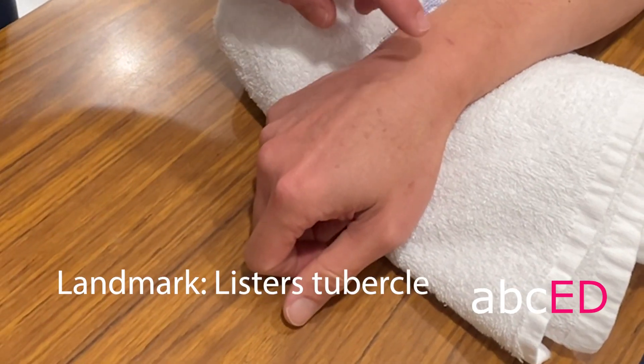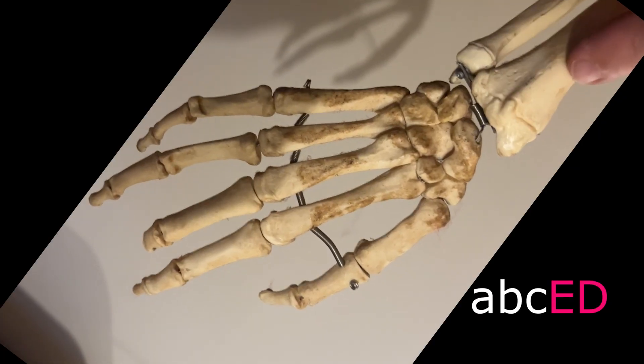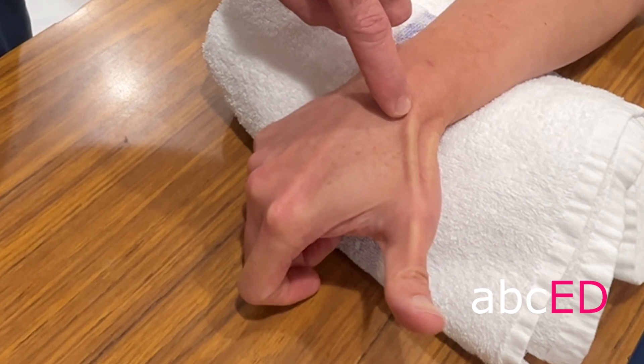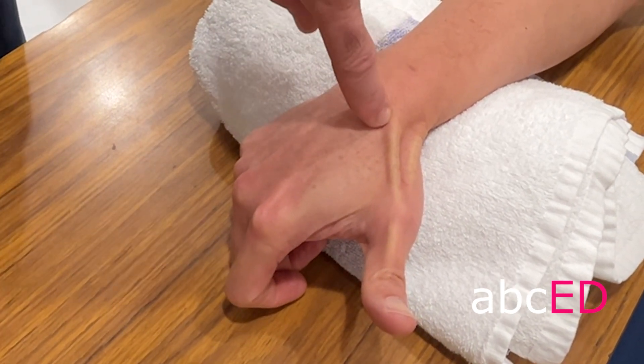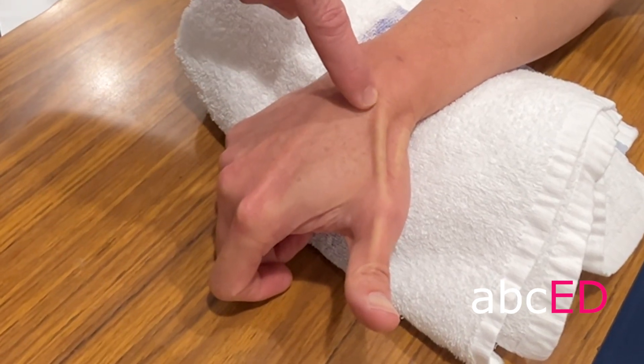The landmark is Lister's tubercle, which is the distal end of the radius. How do you find that? Get your patient to extend the thumb, identify the tendon, and then you're going to go just medial to the extensor pollicis longus tendon, just distal to Lister's tubercle. So that's the spot we're going to go.